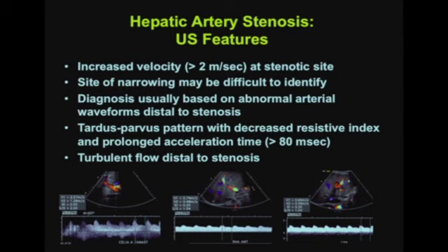So here we see proximally near the anastomosis a pretty normal looking arterial waveform, but as we proceed more distally into the liver, we see on the right a pretty dampened arterial waveform, rounded, and an abnormal arterial waveform in the left hepatic artery as well.